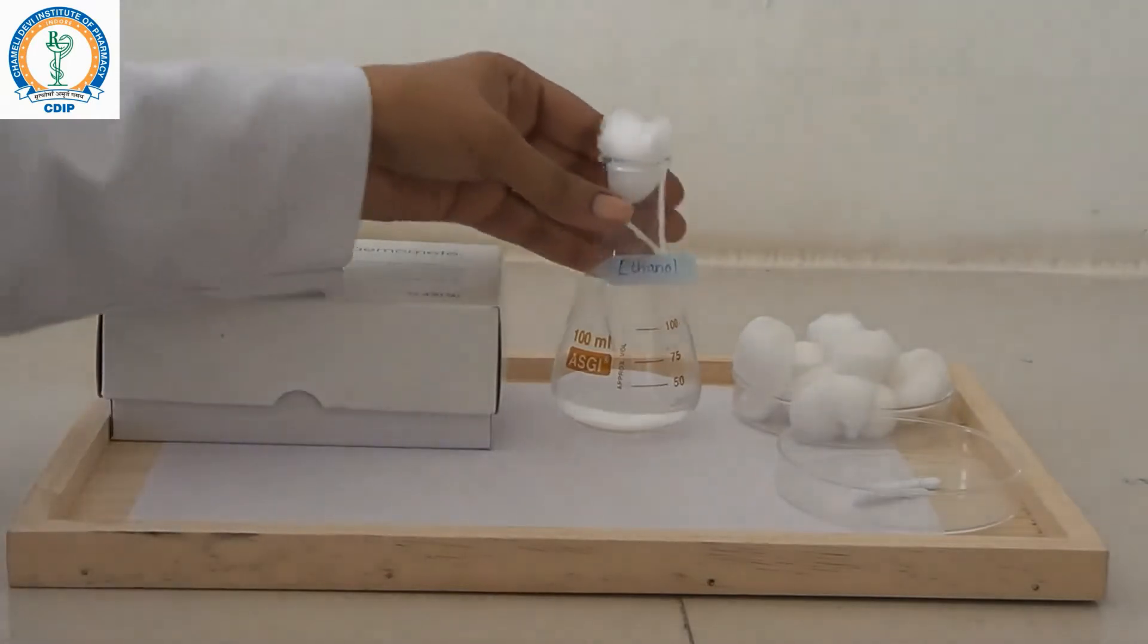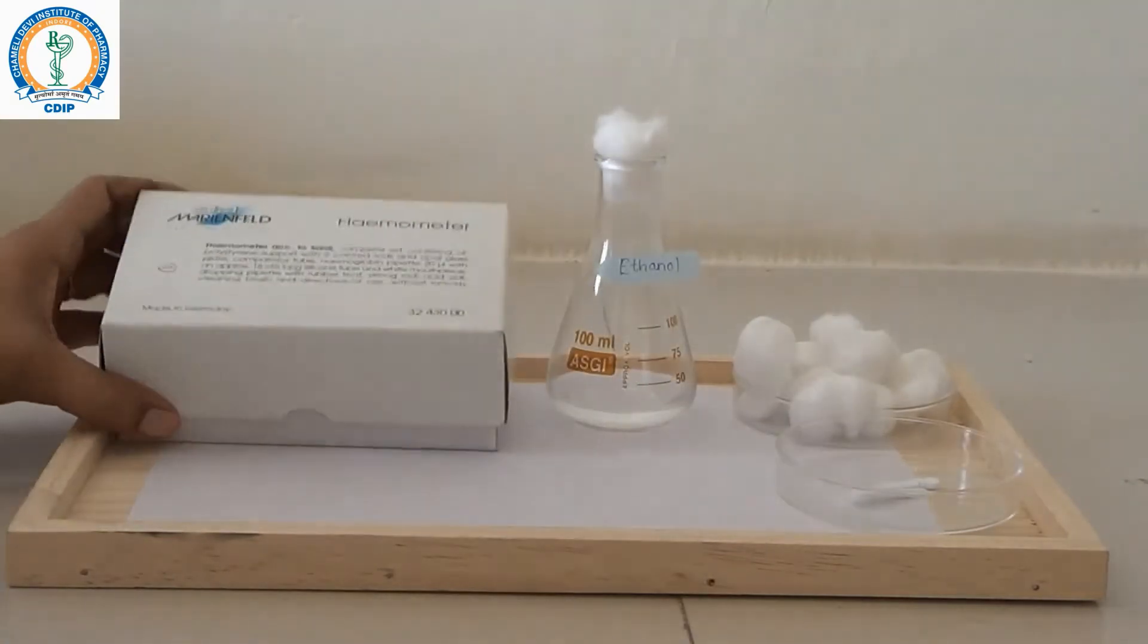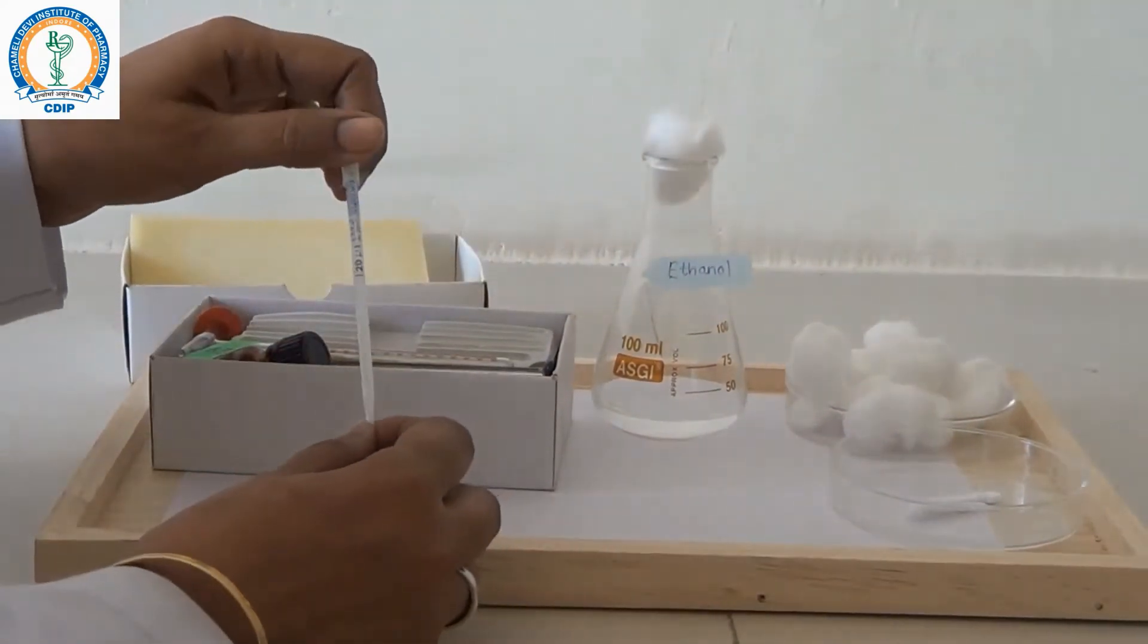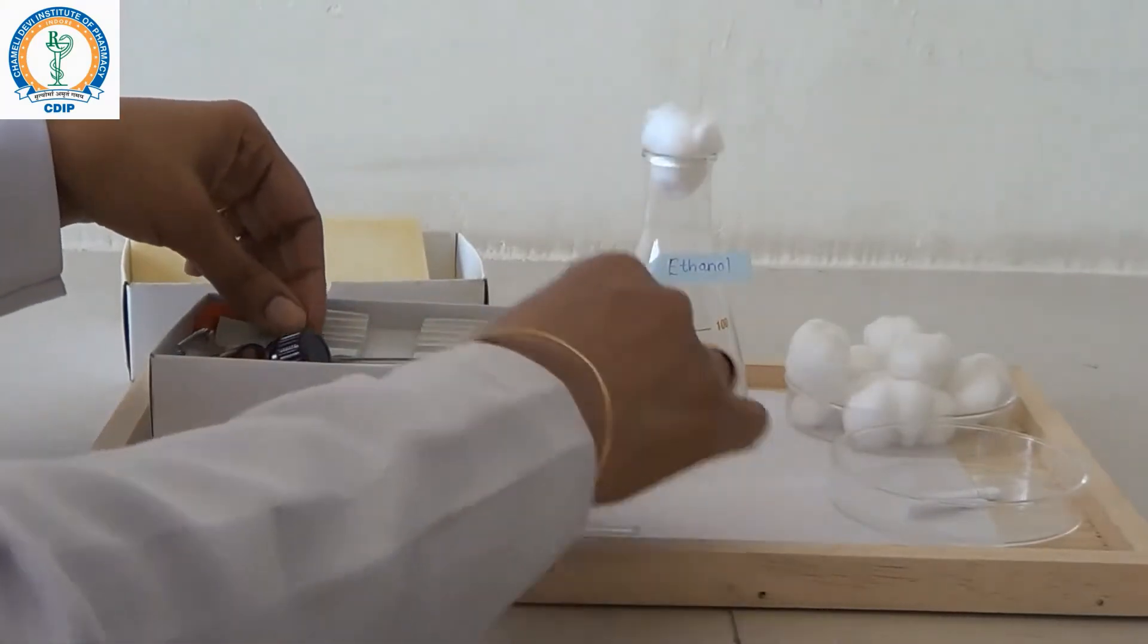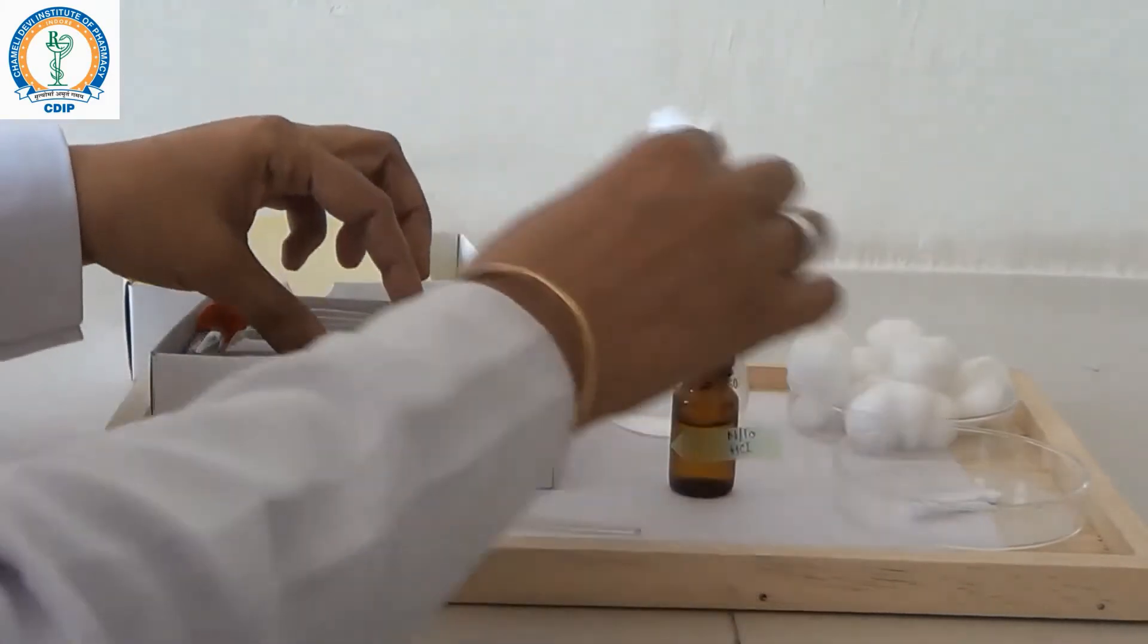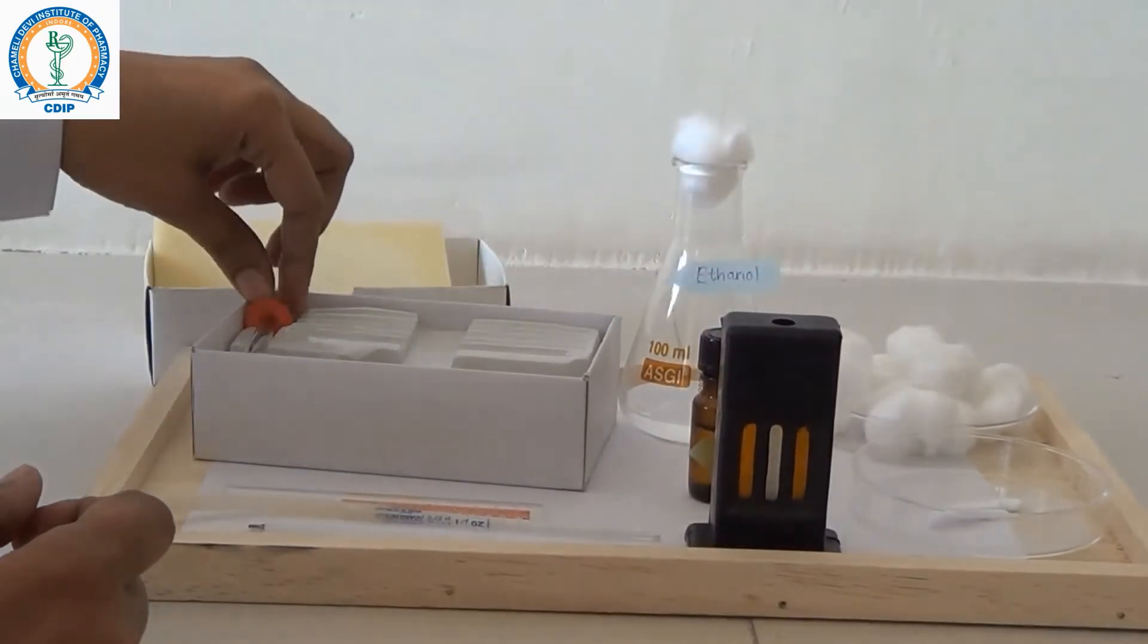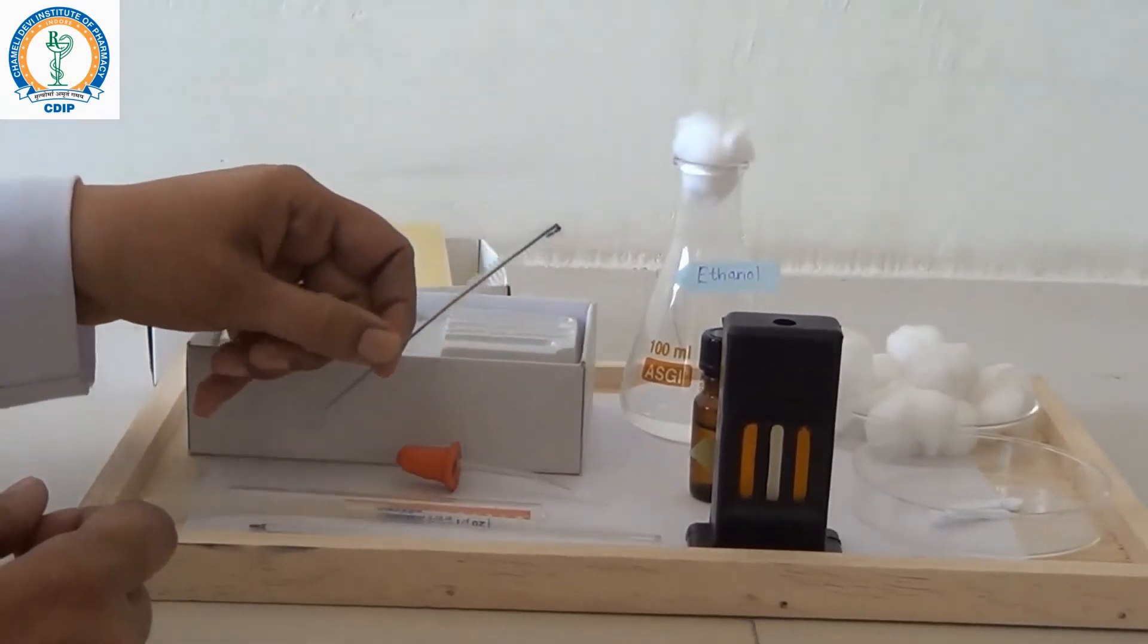For this, we require 99.9% ethanol, cotton, lancet and Sahli's hemometer, which comprises a hemoglobin pipette of 20 microlitre capacity, a graduated tube, N by 10 HCL, mixing rod, a comparator stand, dropper, and a bottle brush for cleansing purpose.